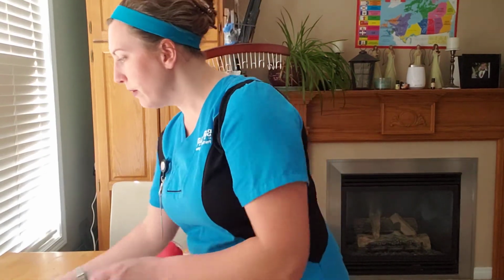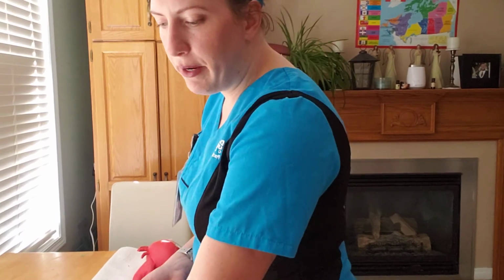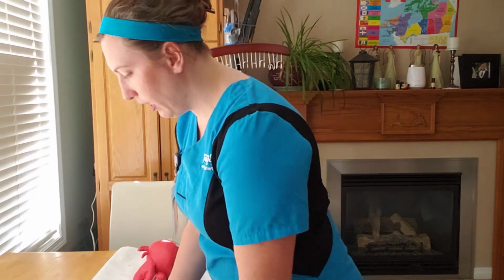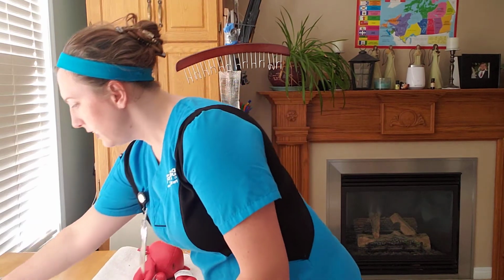So now I'm going to set my orders aside. I'm going to head into the med room, wash my hands again. Okay, so I'm in the med room. I've compared my order to the MAR. So now we're going to be working off of the MAR. Okay. So ranitidine.